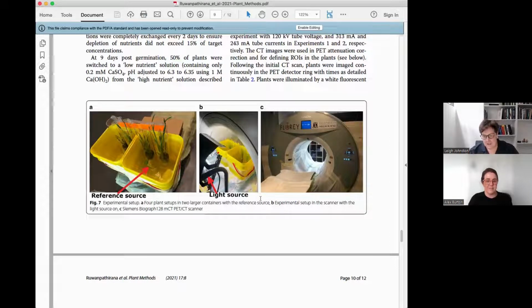Opening up uses of our scanner quite literally, as you can see in this image here. So this is the system before our upgrade last year of the PET-CT, and usually there are people putting their heads in there. And we did this imaging over a couple of weekends in which we made very, very certain to plastic wrap the scanner essentially to make sure that this type of radioactivity didn't contaminate everything else. But essentially what we're looking at here is tracking the sodium dynamics.